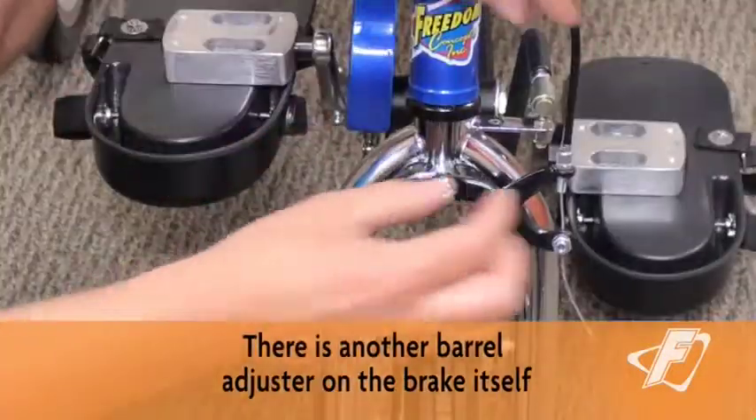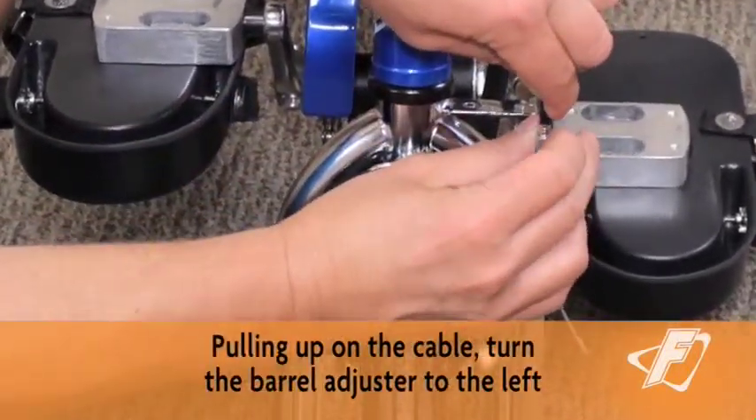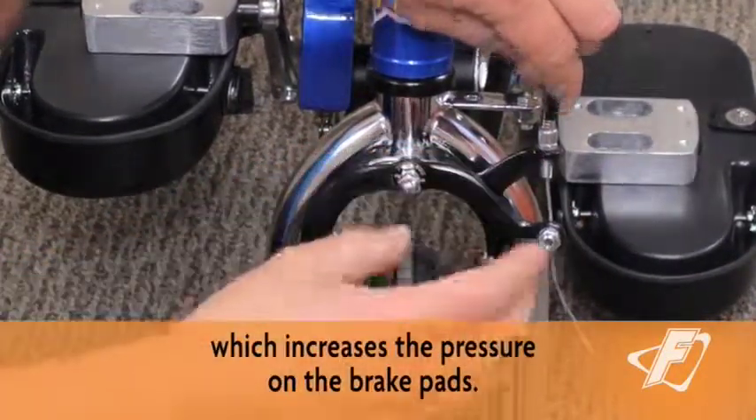There is another barrel adjuster on the brake itself. Pulling up on the cable, turn the barrel adjuster to the left and re-tighten the lock nut to add tension to the cable, which increases the pressure on the brake pads. You're ready to ride.